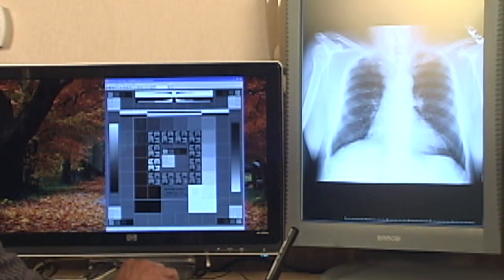Often you switch them on in the morning, and if it's a commercial grade monitor that does not have the closed loop circuit, you might not want to look at anything diagnostic for the first 15 minutes. If you're going to calibrate it with either a software solution or a hardware-software solution, you definitely want to let it warm up for at least 30 minutes, to achieve some kind of thermal stability in the backlights.